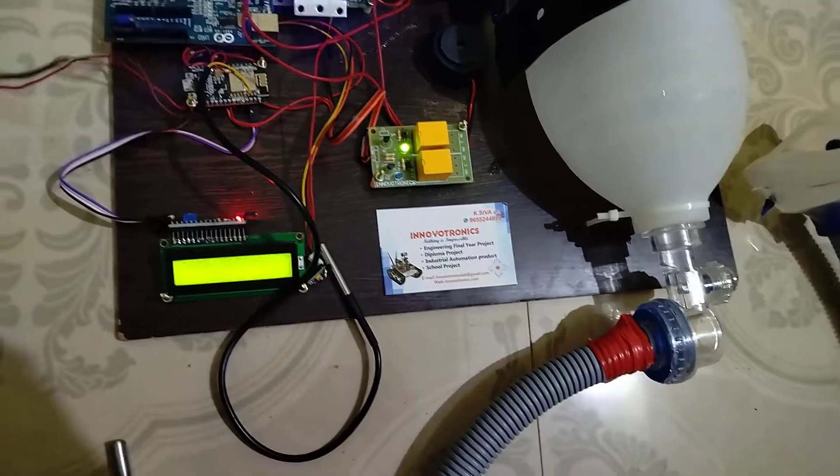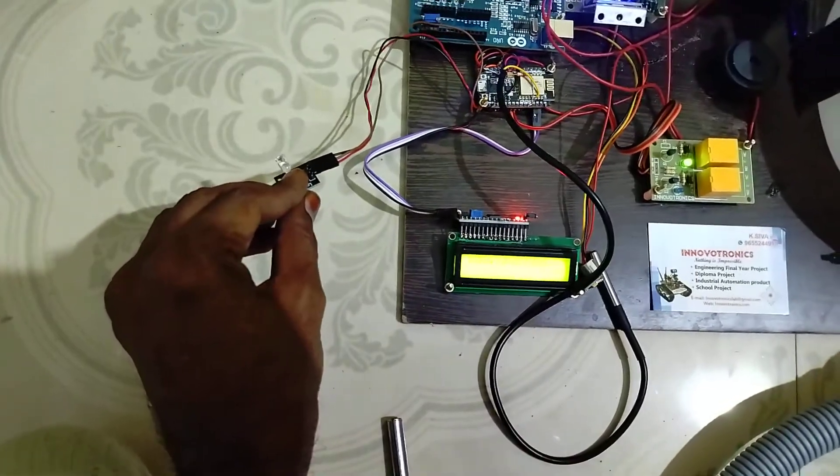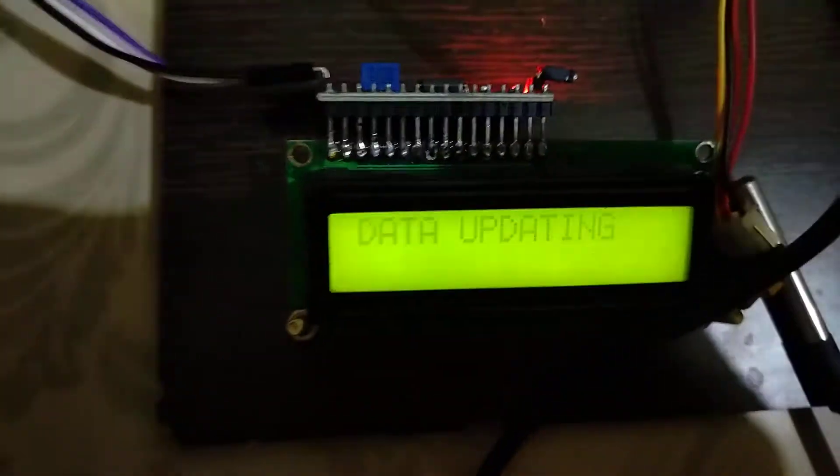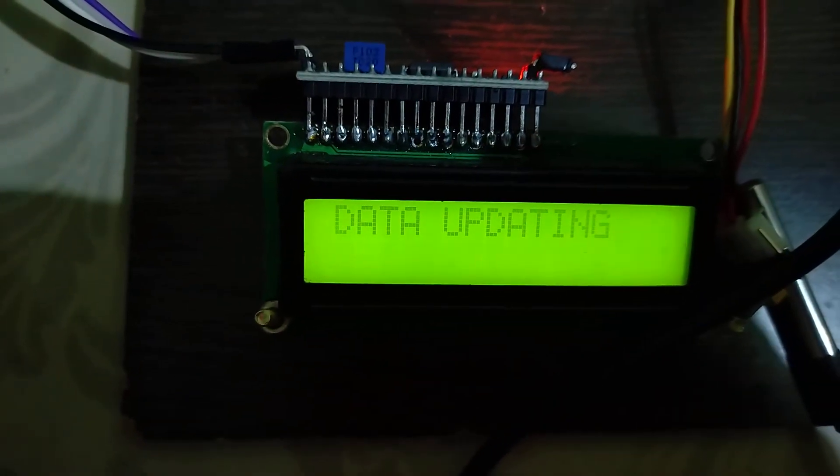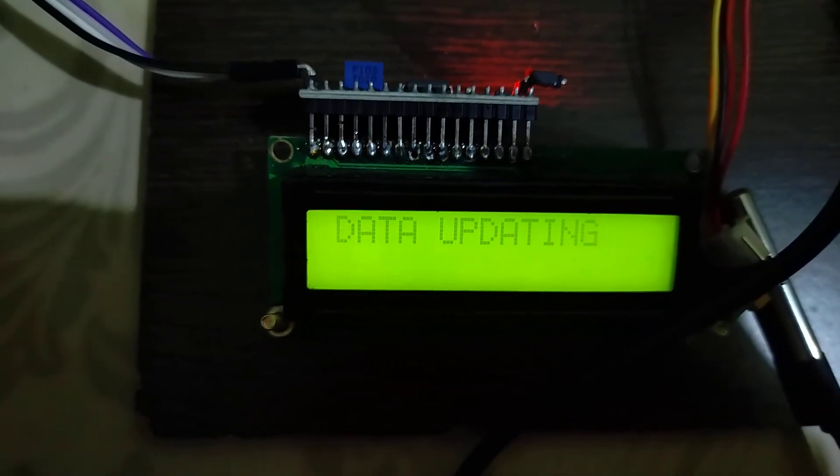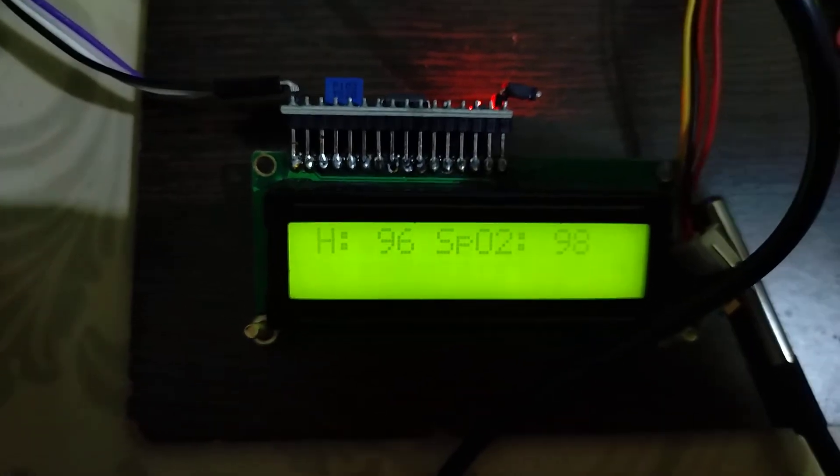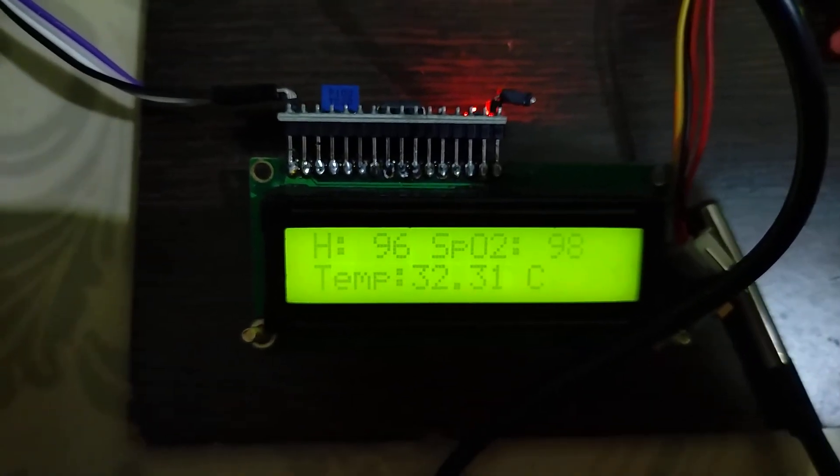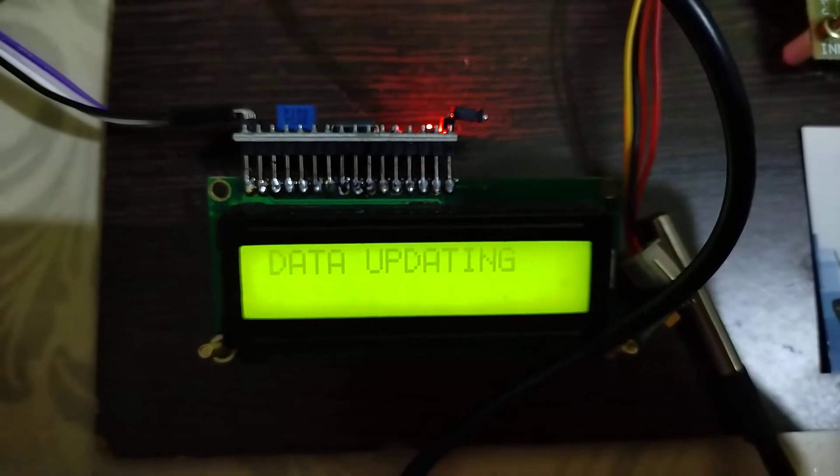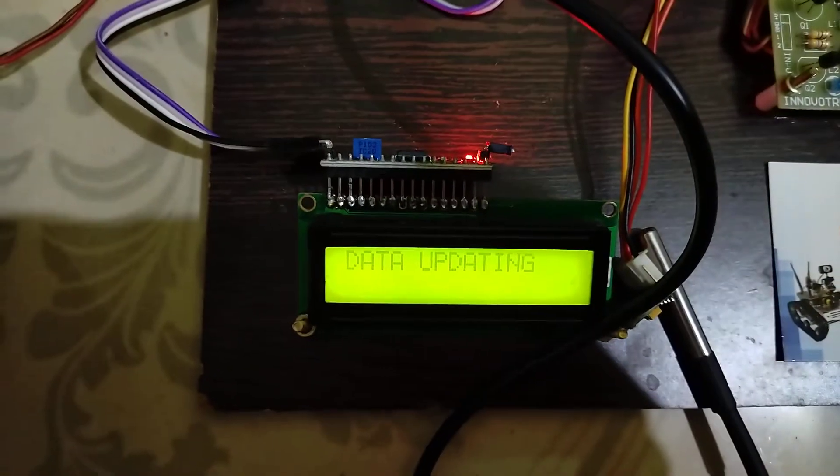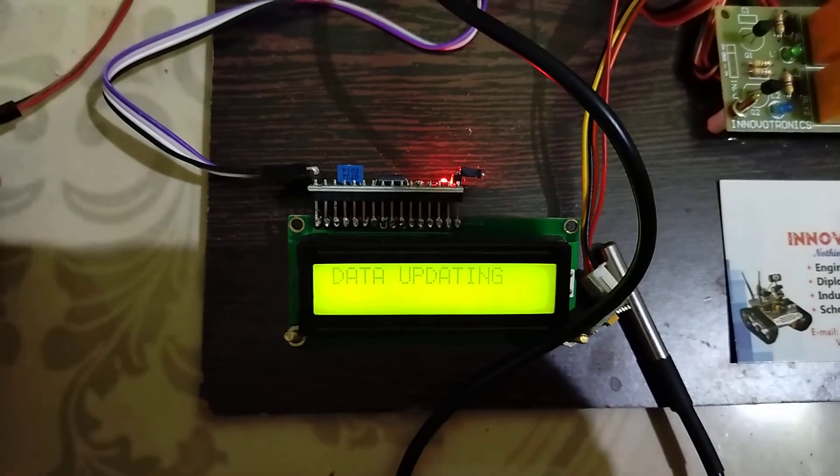The heartbeat data will take some time. Now you can see the heartbeat is 96 and SPO2 is 98. It will update this data to the cloud.